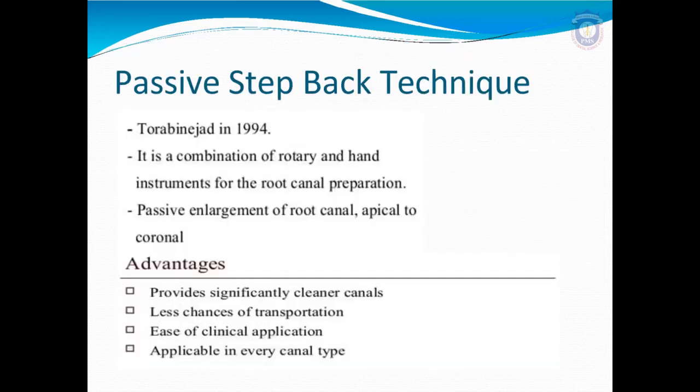Passive step-back technique was introduced by Torabinejad in the year 1994. It is a combination of rotary and hand instruments for root canal preparation. Passive enlargement of the root canal, apical to coronal portion, is done in passive step-back technique. The advantages of passive step-back technique are that it provides significantly cleaner canals, less chance of transportation, ease of clinical application, applicable in every canal type.